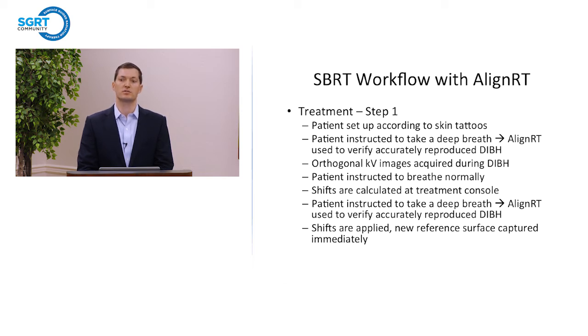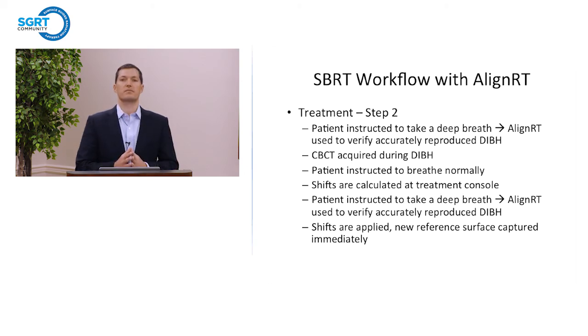Once those shifts are determined, the patient is then again instructed to take a deep breath. Once that deep breath has been verified to be accurate by AlignRT, the shifts are applied, and then within about half a second or a second of application of those shifts, a new AlignRT reference surface is acquired.